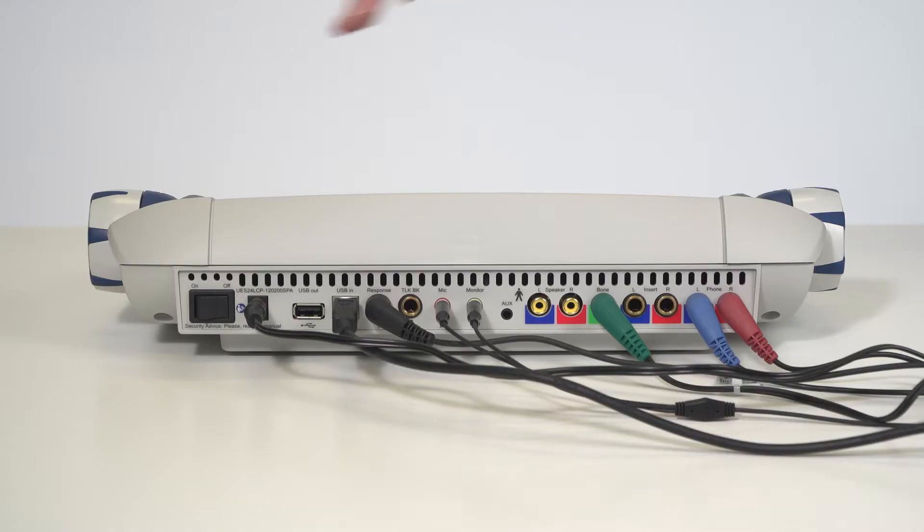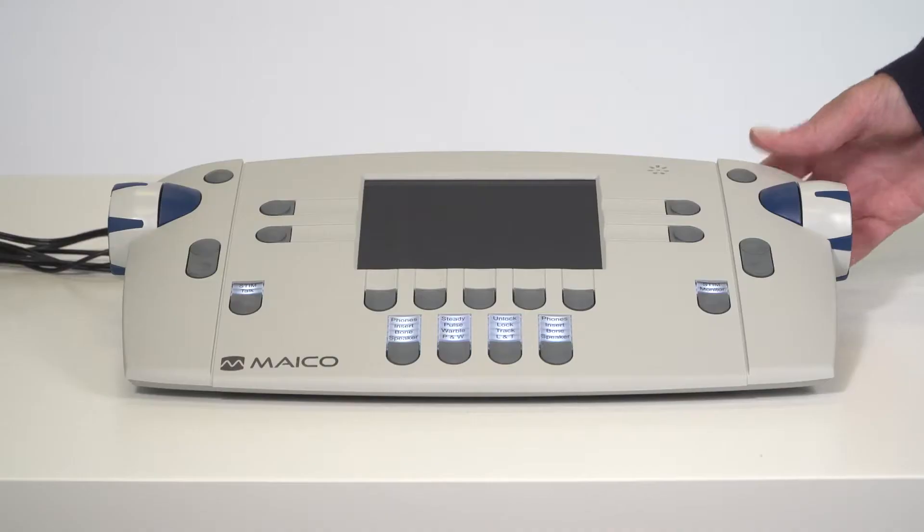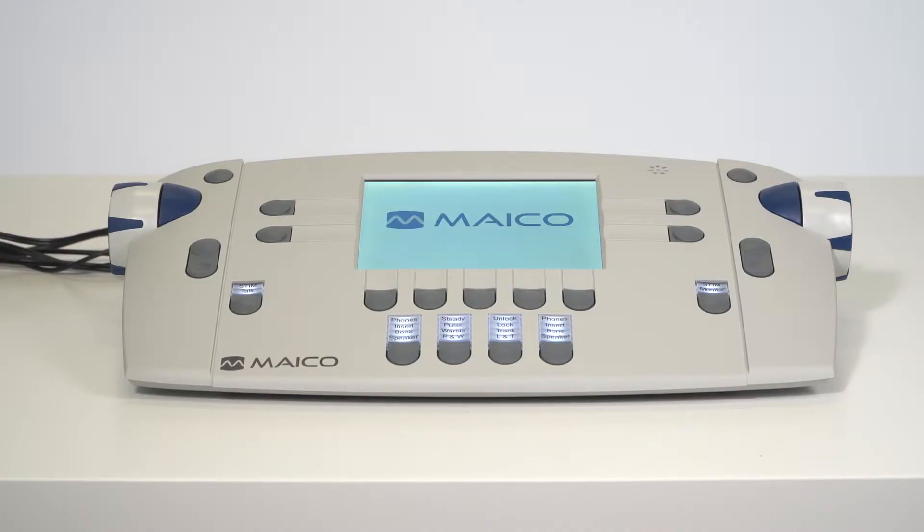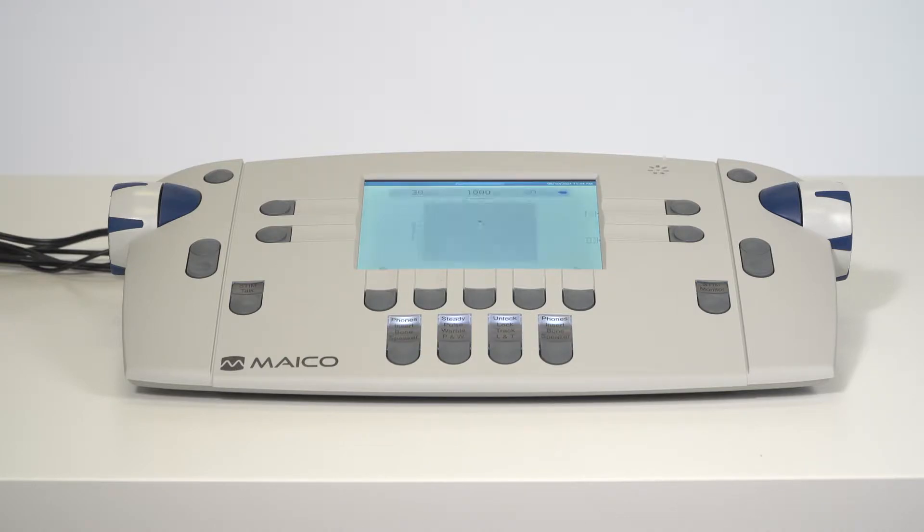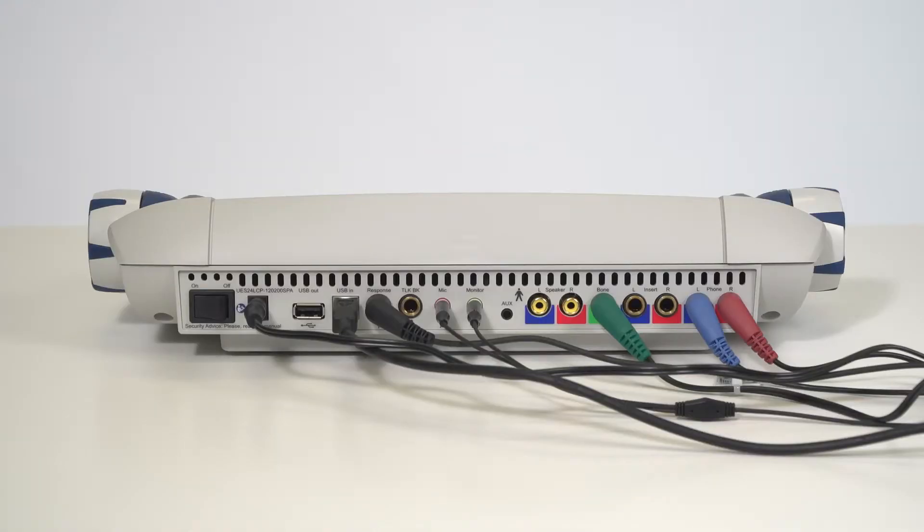To turn on the audiometer, flip the power switch on the back of the unit. You will see the display screen light up and then the Mako logo appears. It will take a minute to boot up. Make sure all the accessories are properly connected to the audiometer before turning on the device.